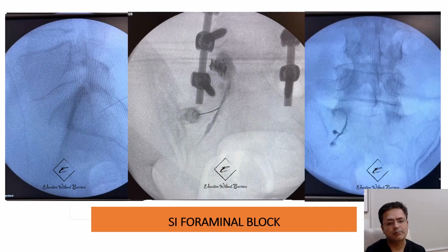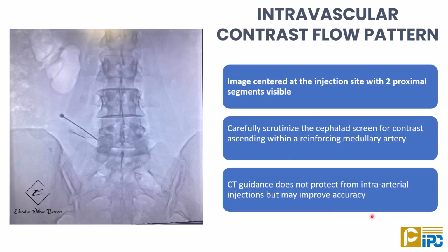We'll talk about that in a separate video. Now, you've understood the technique. Let's look at some evident contrast patterns which you should be able to recognize.